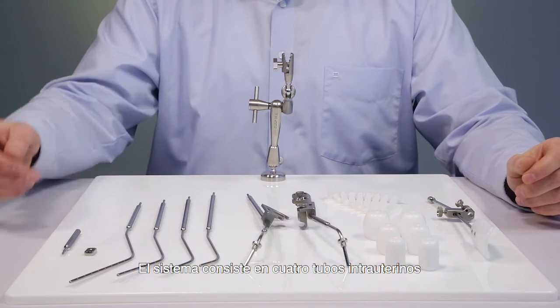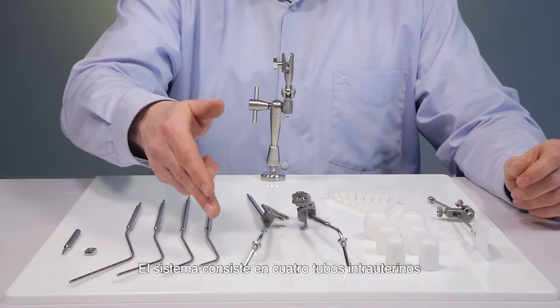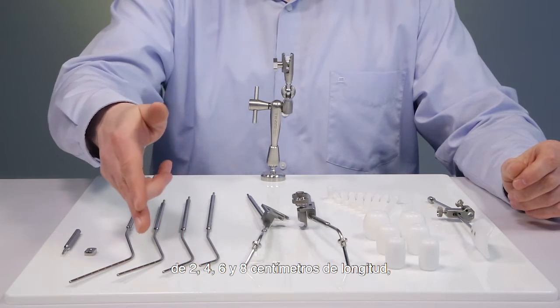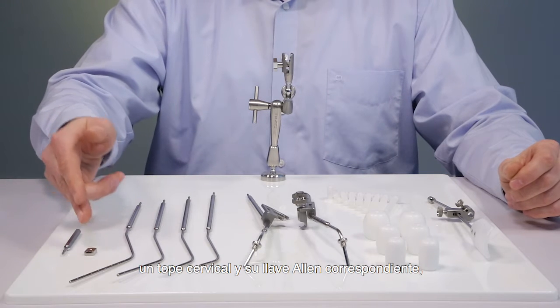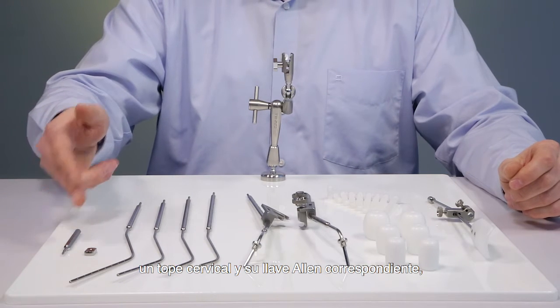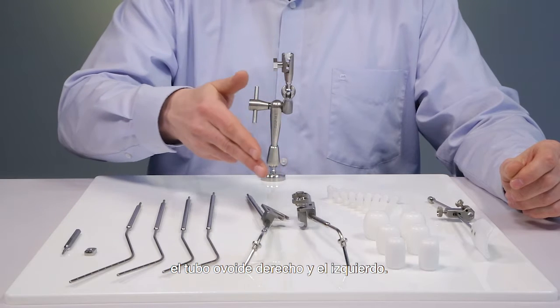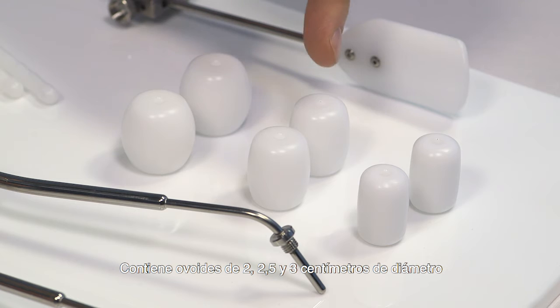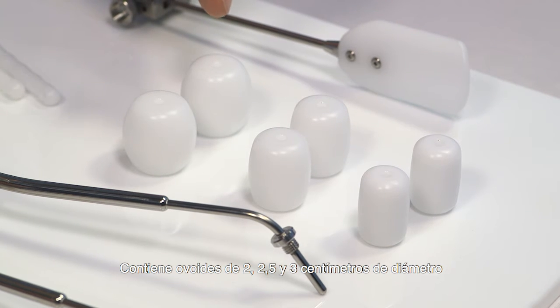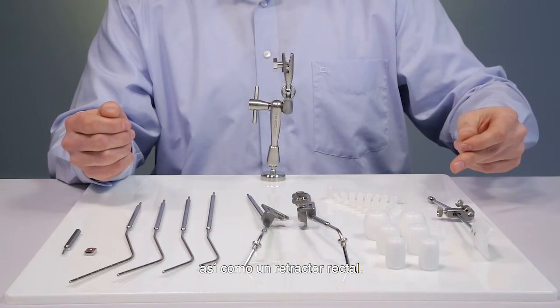The set consists of four intrauterine tubes in 2, 4, 6, and 8 centimeter length, a cervical stop and a corresponding Allen wrench, the right ovoid tube and the left ovoid tube. It includes ovoids in 2, 2.5, and 3 centimeter diameter, as well as a rectal retractor.